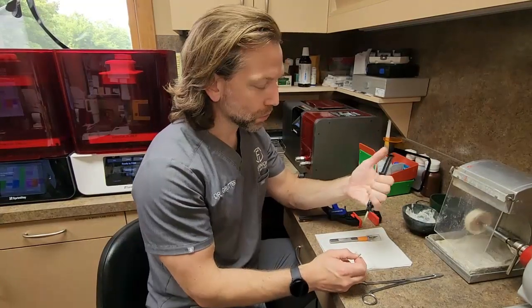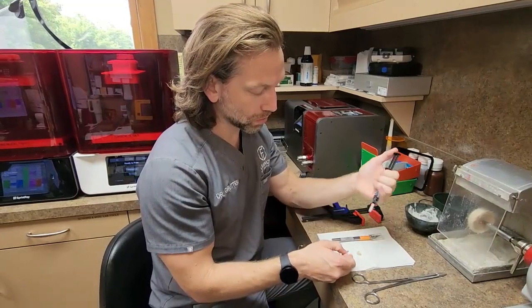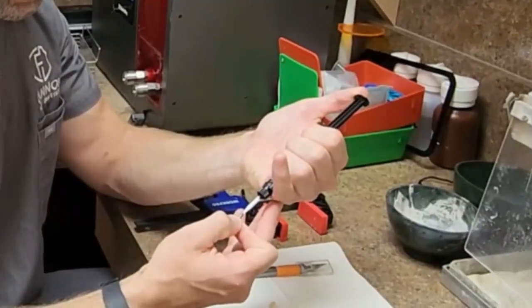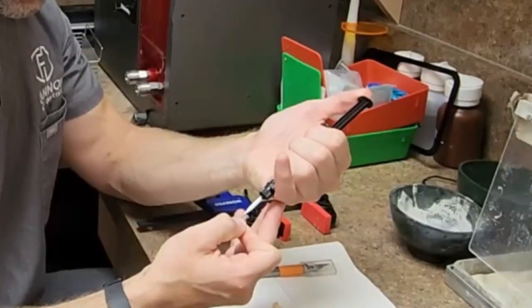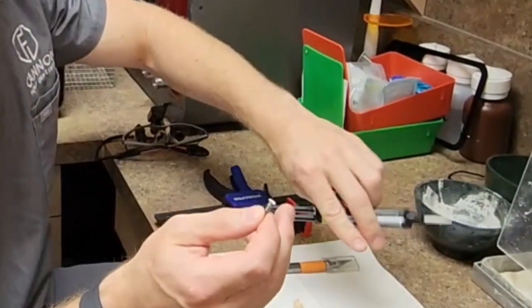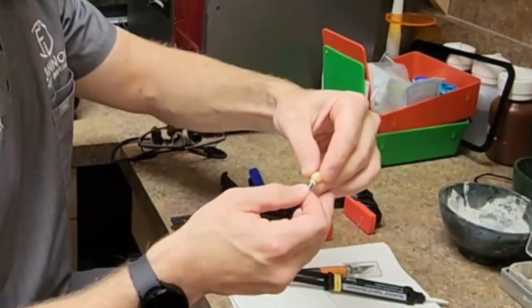Why not make it easier? I'm going to make a small bead right around the very top of this abutment, and that's it. We don't need a lot because there's not a lot of space to fill — it's a precision fit.